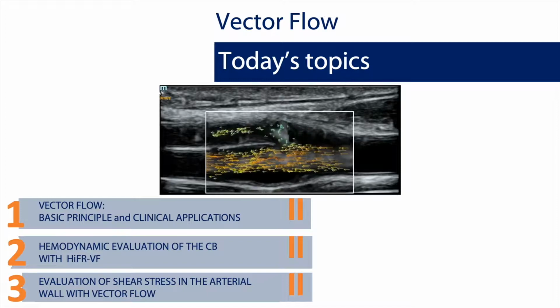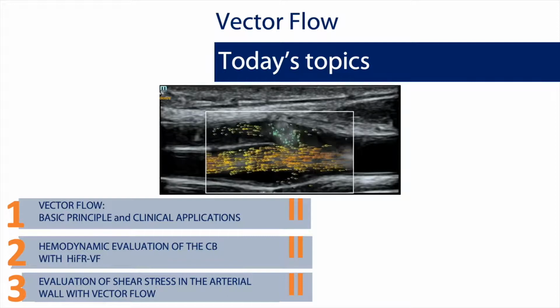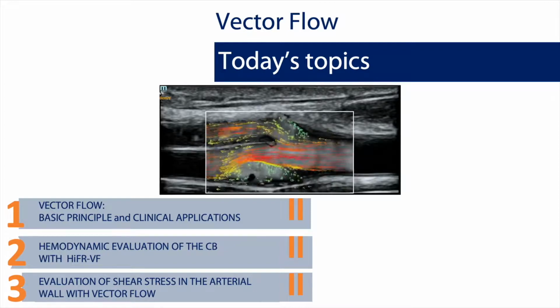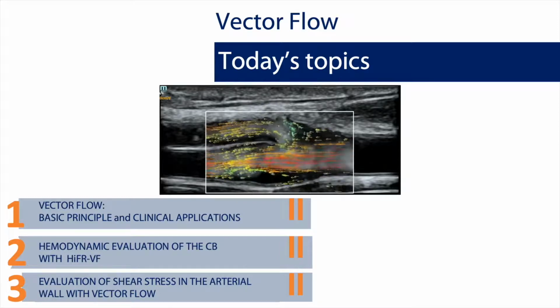Today's topics will consider basic principles and clinical applications of vector flow, hemodynamic evaluation of the carotid bifurcation with high frame rate vector flow, and lastly, the evaluation of shear stress in the arterial wall with vector flow.